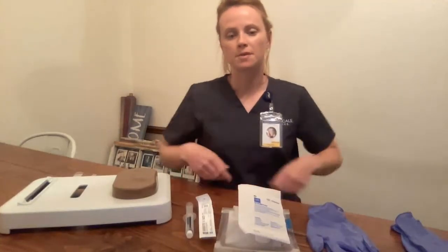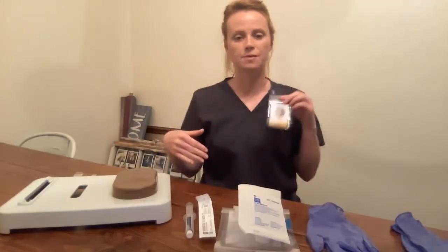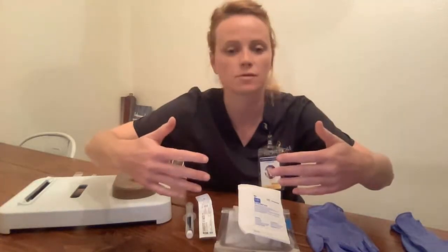Hi, my name is Emily. I'm going to perform the skill video inserting and discontinuing an IV. I'm in the appropriate school attire. My badge is visible. No polish, no jewelry.